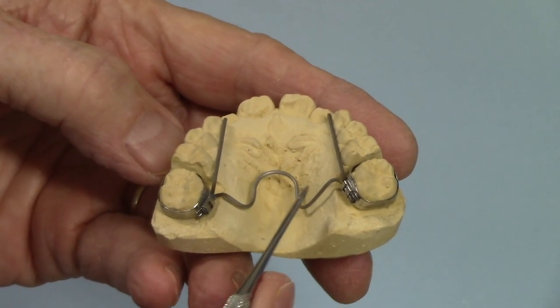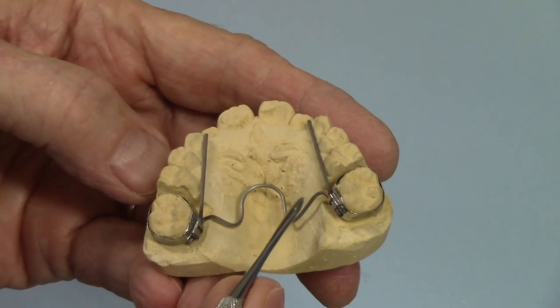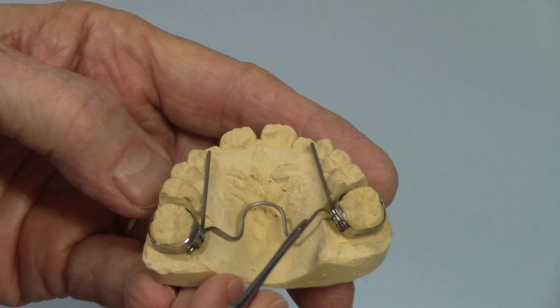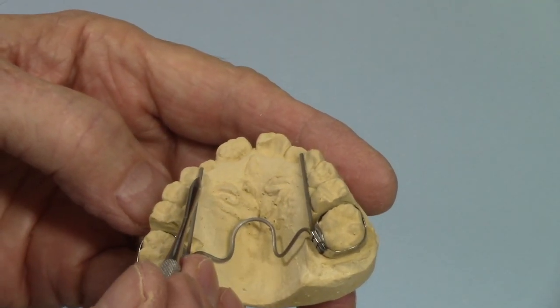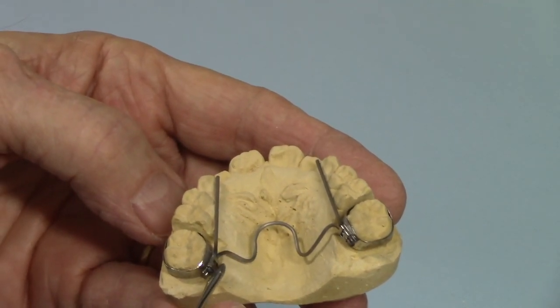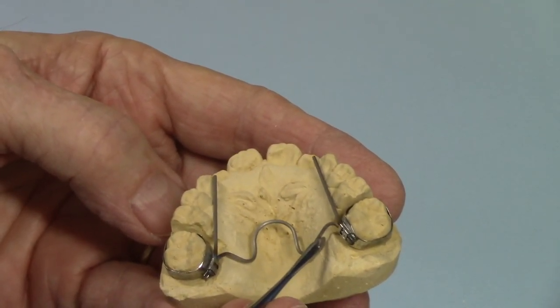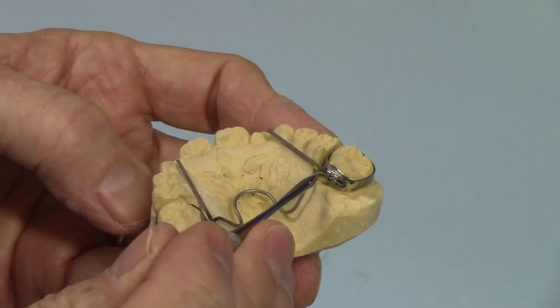Here's an expansion appliance I'm making using the 036 beta 3 titanium alloy wire. This is a continuous wire, and I like this because both the lingual arms and the active part of the appliance are titanium. It just makes it a nice flexible appliance. It's a little tricky on the wire bending, but it makes a real good appliance.